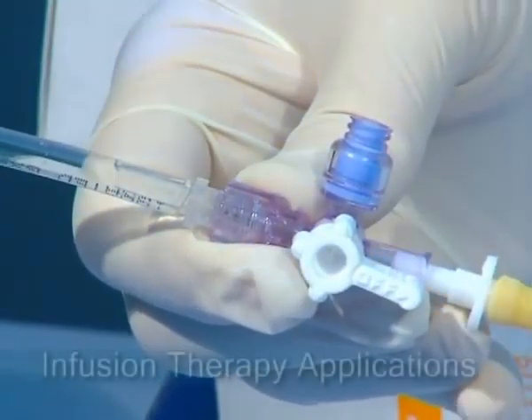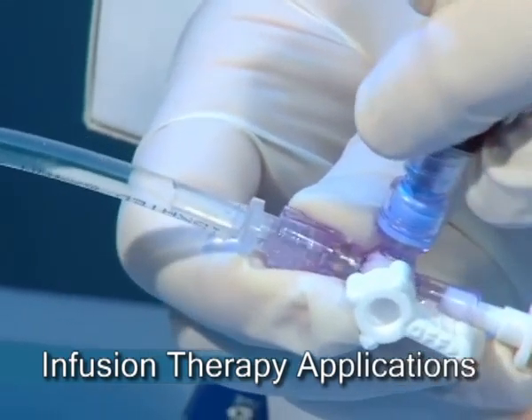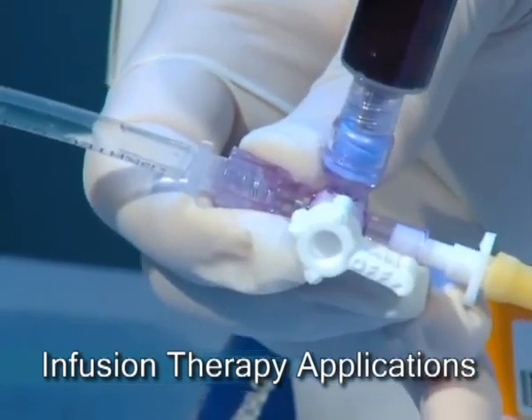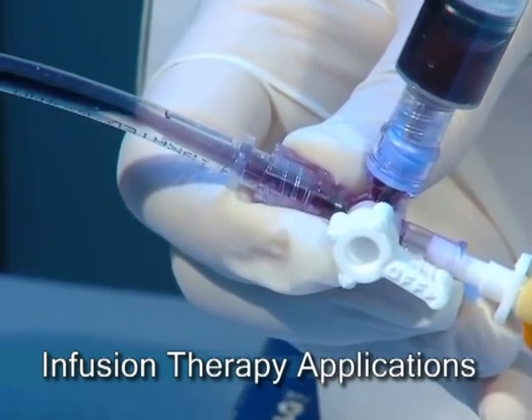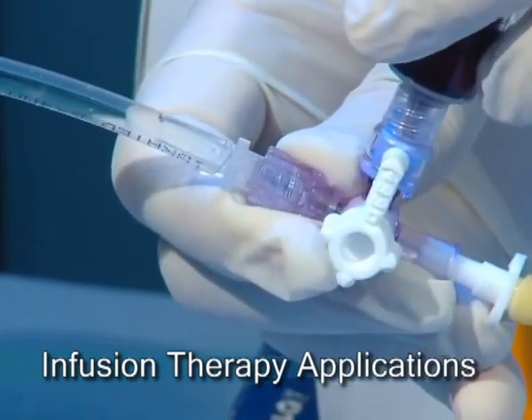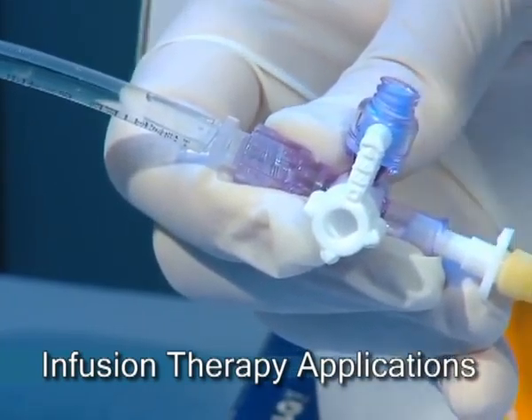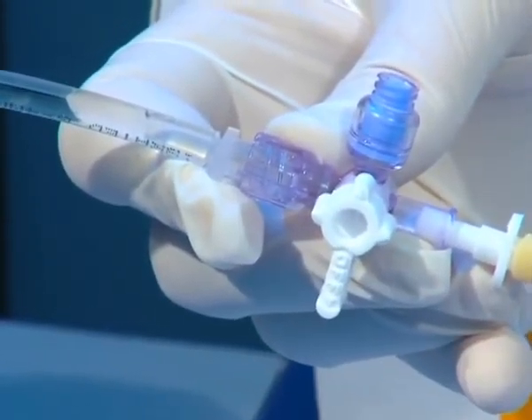The Marvelous stopcock is also very useful for IV lines such as central lines. For example, when administering medication by bolus, the Marvelous ensures that the entire medication will reach the patient and also facilitates the work of nurses, who only have to turn the handle into the all open position at the end of the injection.